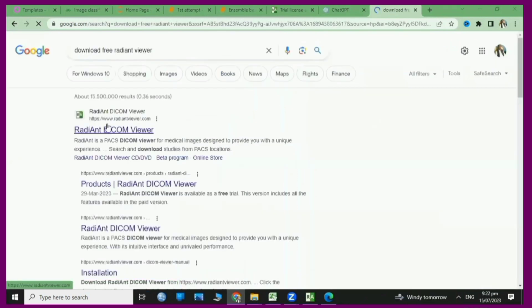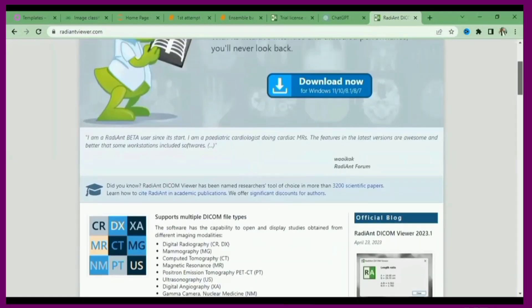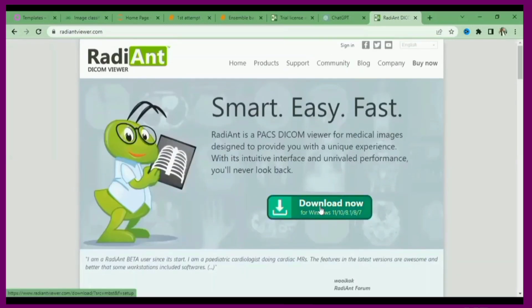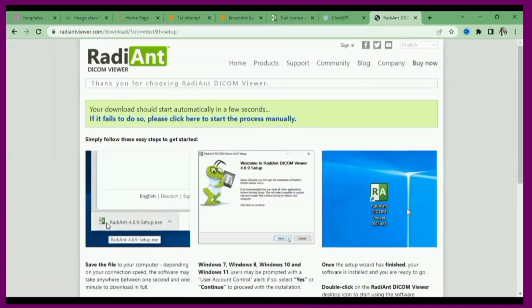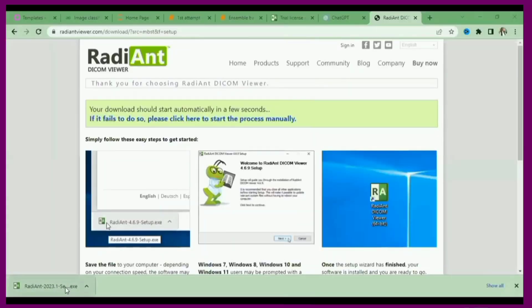Today we are going to install a ready DICOM image viewer. I searched for it on Google, downloaded it, and I am following those instructions to install it.